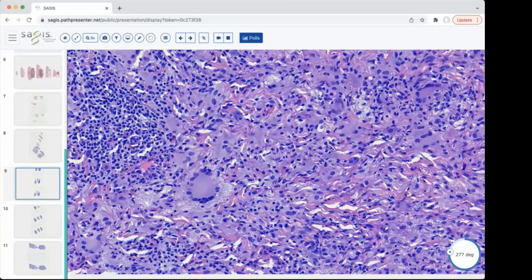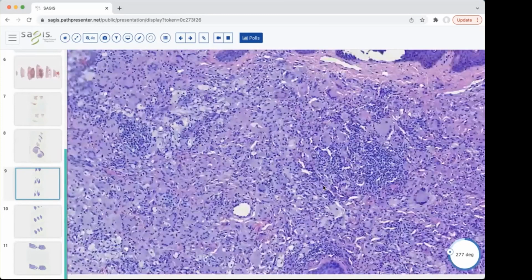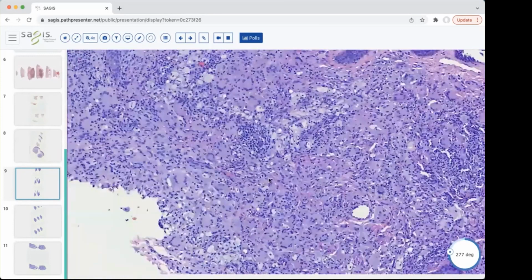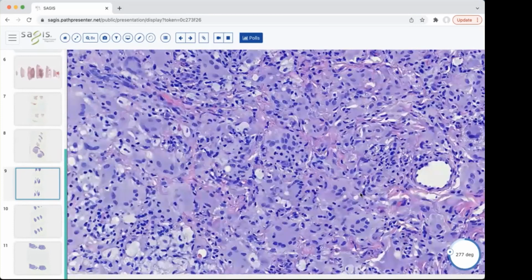And so these histiocytes, if you look at them, they're almost a little bit more foamy, but have this deeper purple color to them. The scattered Toutons often go along with this. And you can have the lymphocytic inflammation as well. I'm trying to come over to the edge here. Good, I think that's a good example of what this is.